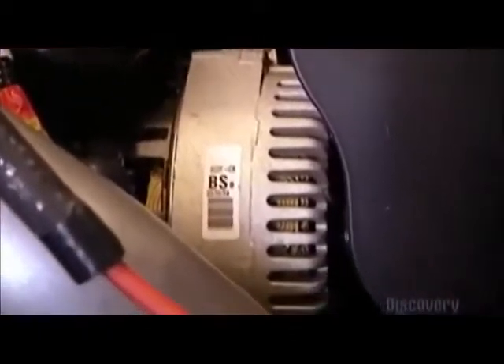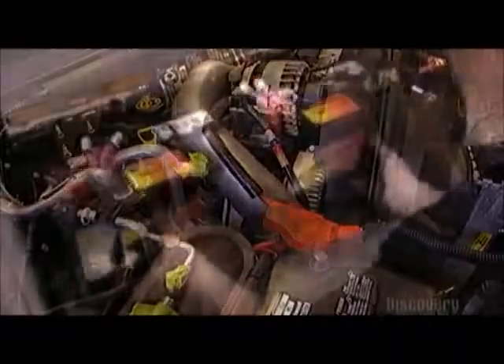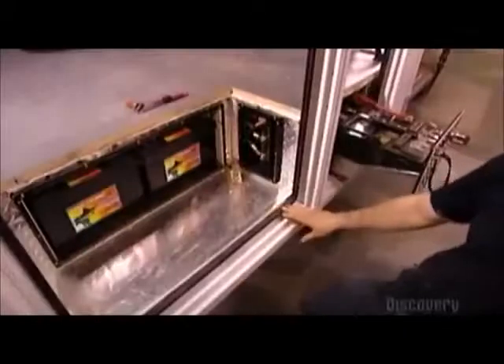The truck comes equipped from the automotive plant with certain options designed for conversion to an ambulance. For instance, instead of two regular batteries, the truck takes two new pairs of batteries — one set to power the truck accessories, the other to power the equipment in the back.